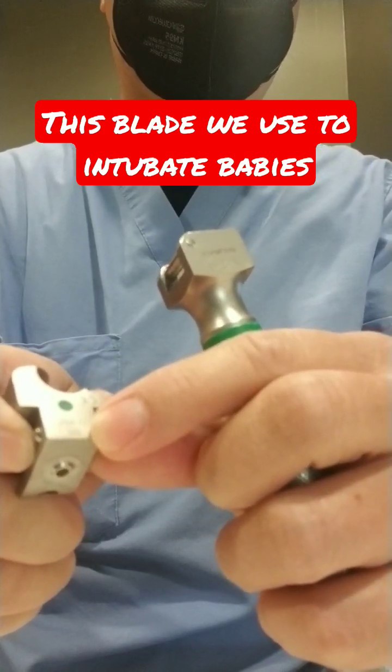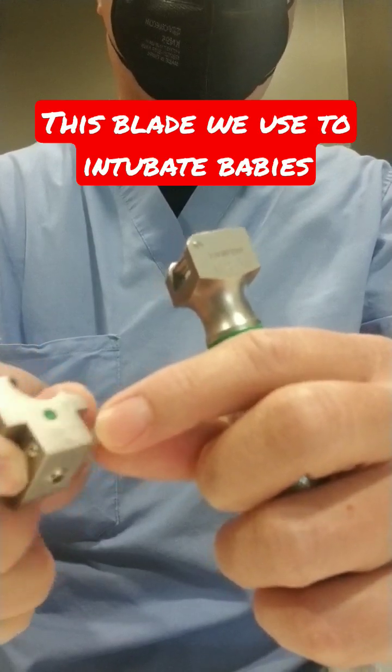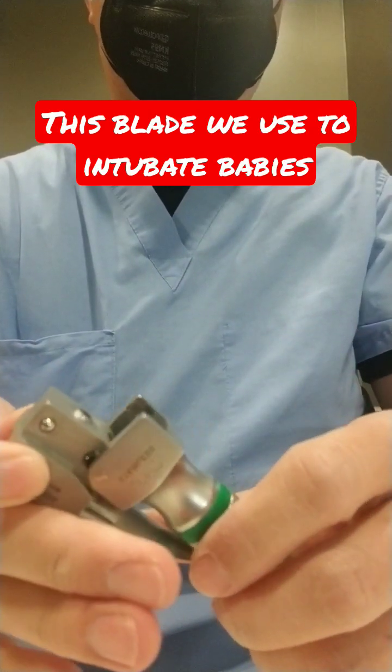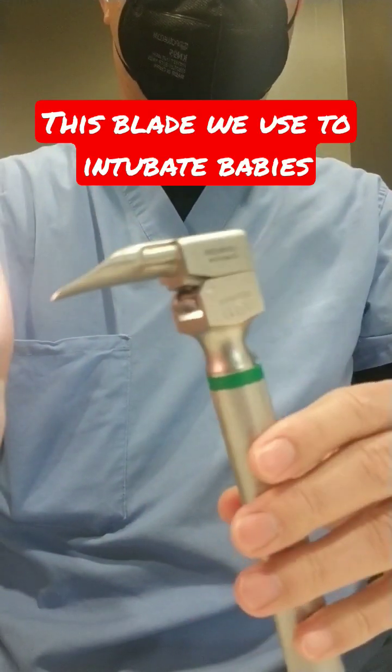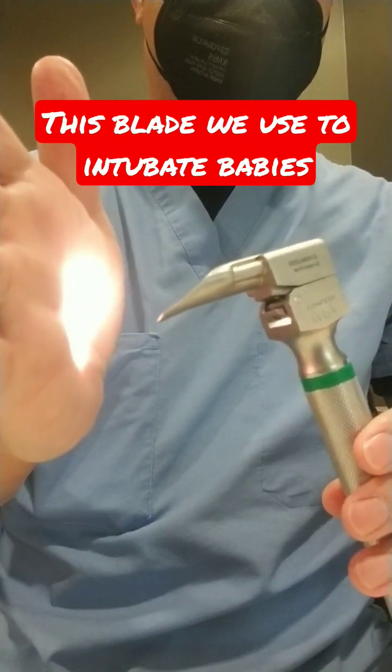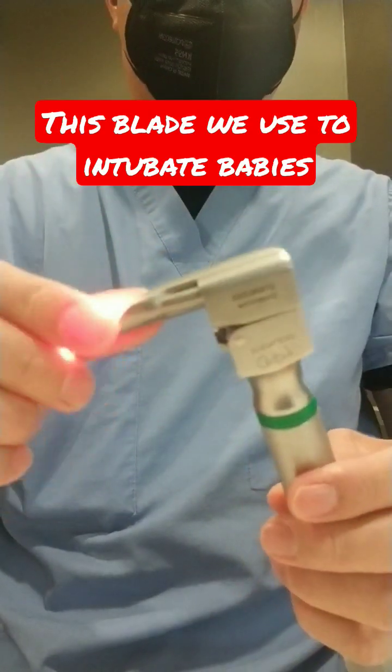For those babies who are so tiny — micro preemies — we use a double zero. You attach this one, and voila, you can see there's light to guide us when we put down the tracheal tube.